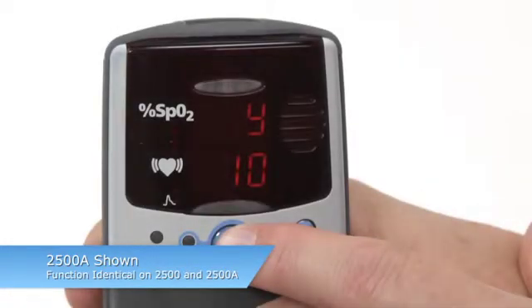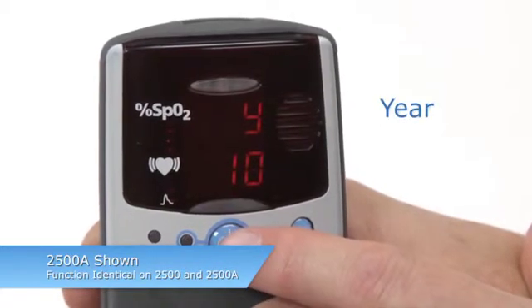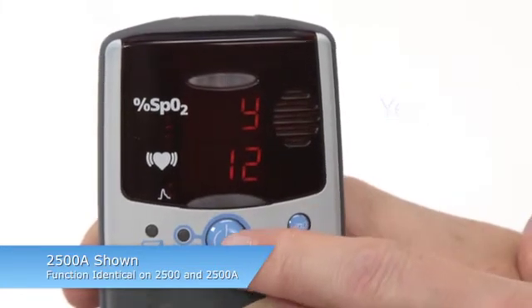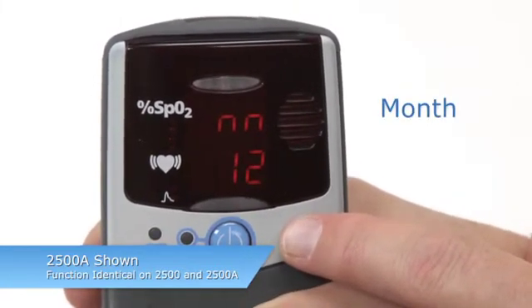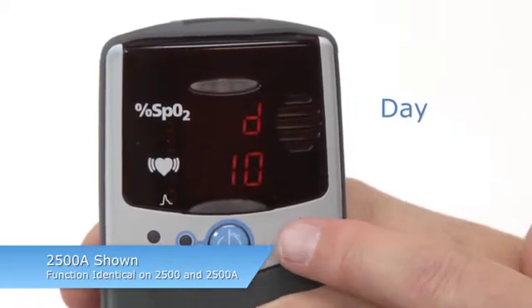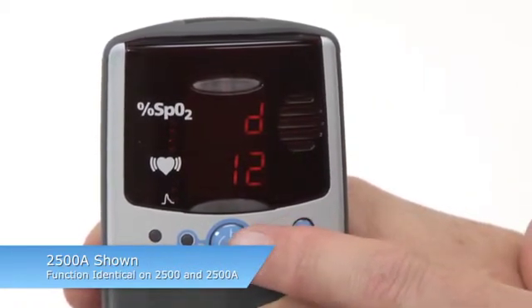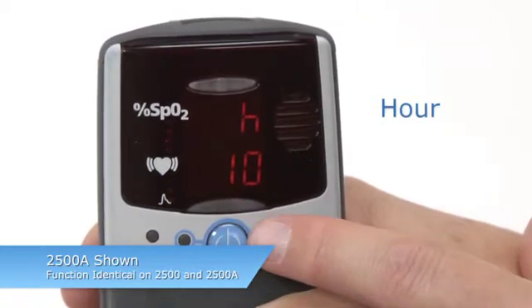Year, month, day, hour, and minute will appear in that order as you adjust them. Change the value by pressing the ADVANCE button until the desired value appears, and then press ON-OFF to set that value. The next value will then appear. You can also scroll through values by pressing and holding the ADVANCE button.